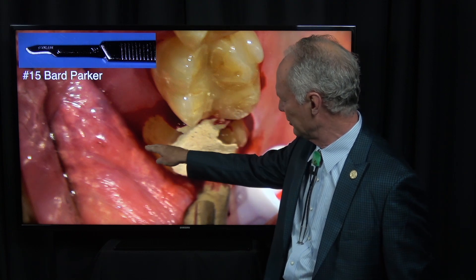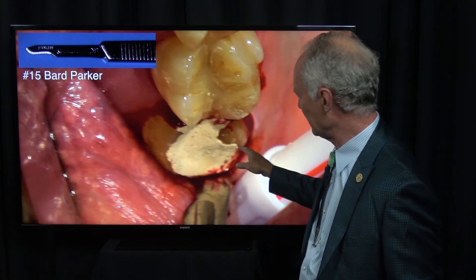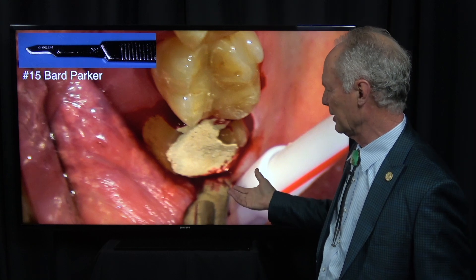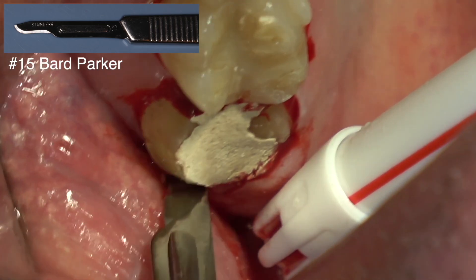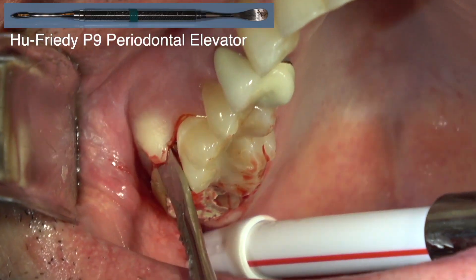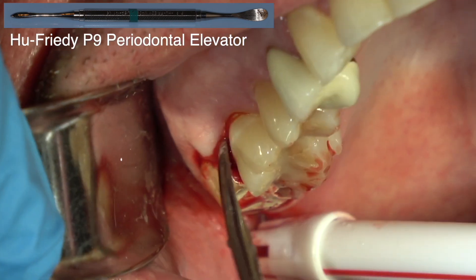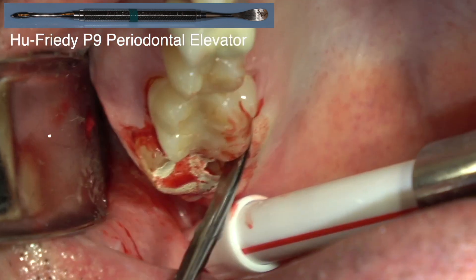I'm going to cut between the roots and take the roots out in three parts. I know this tooth is probably going to be brittle, so I'll probably have to take each root out in parts. This is a big tooth, and if I extract it in one piece it's got to be extracted to the facial and I'm going to lose all the facial bone. So it's got to be sectioned into three parts for each root.